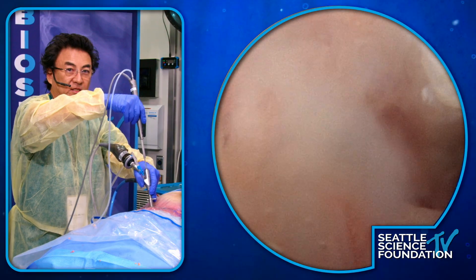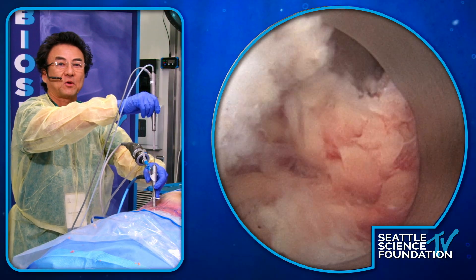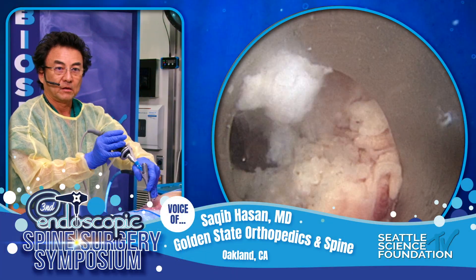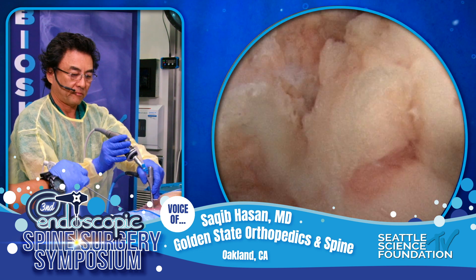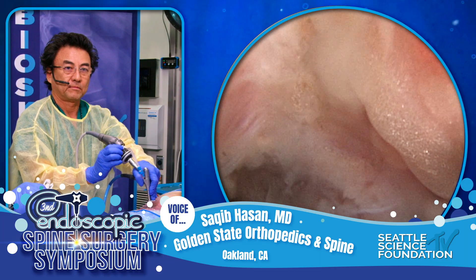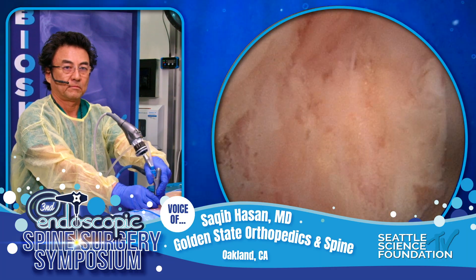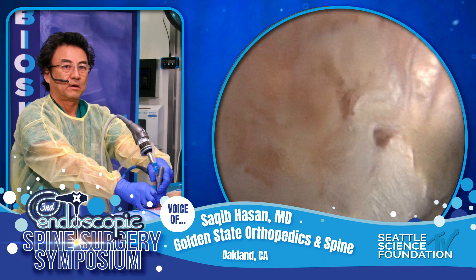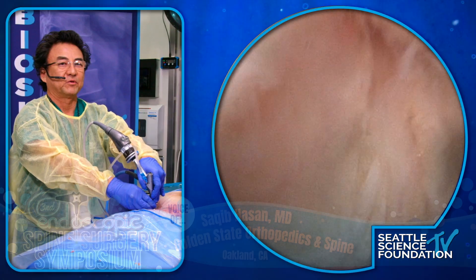What I'd like to do is just show you its performance profile on the bone. When you're using that bone scalpel — the ultrasonic scalpel — do you typically not take a big piece of bone because it's hard to remove through the endoscope? Do you take small pieces of bone because it's hard to remove a big piece through the endoscope?